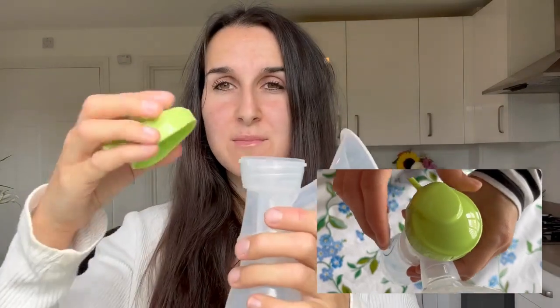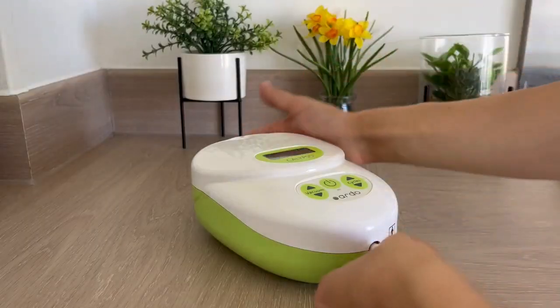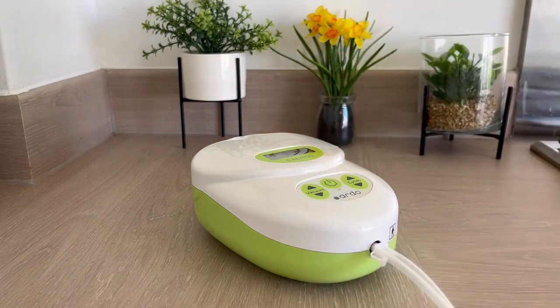Then take the green cap — as you can see, this line here needs to align with the line on the brass shell when we first place the cap on, then we want to rotate it towards the right. The silicone tubing needs to go onto the end of the green cap; the other end of the tubing needs to be connected to the tube connector, which then goes into the front of the pump. Make sure the tube connector is pushed into the port fully.